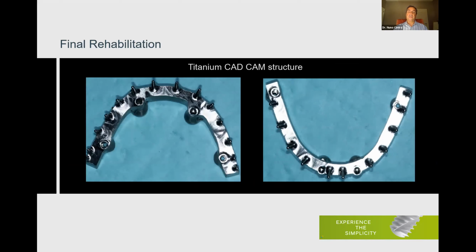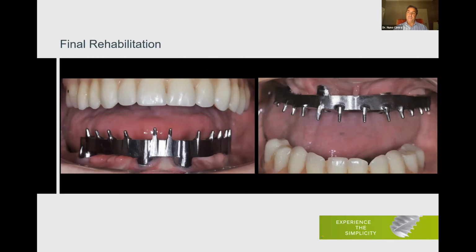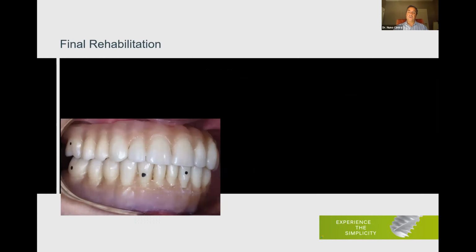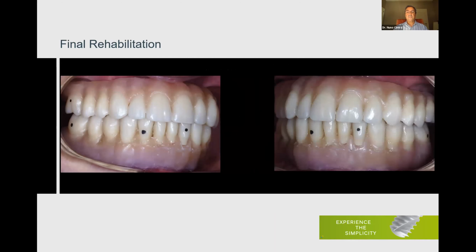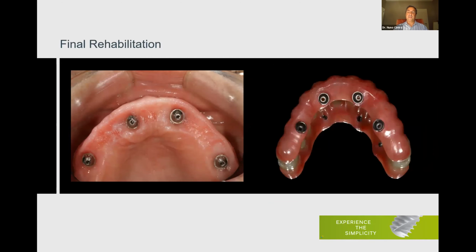Also, of course, you know that the final rehabilitation, the final bridge, is over a titanium CAD/CAM structure. This structure should be passive. And to be passive, we have to try it. Please try it in mouth to make sure that the structure is passive. Also, check occlusion, of course. And after everything is checked, and upon our tracings and our findings with the condylography, we go for a final rehabilitation.